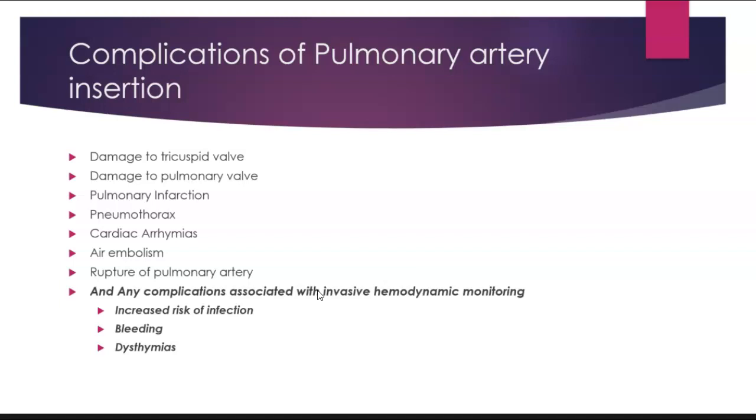Also, there are complications associated with any type of invasive monitoring. Anytime we have a line in our patients, especially a line that's going directly to our heart, we're going to increase our risk of infection. Insertion of lines increases your risk for bleeding. And then, as I mentioned before, because of where this line is located, that risk of dysrhythmia is also a consequence of doing invasive monitoring.